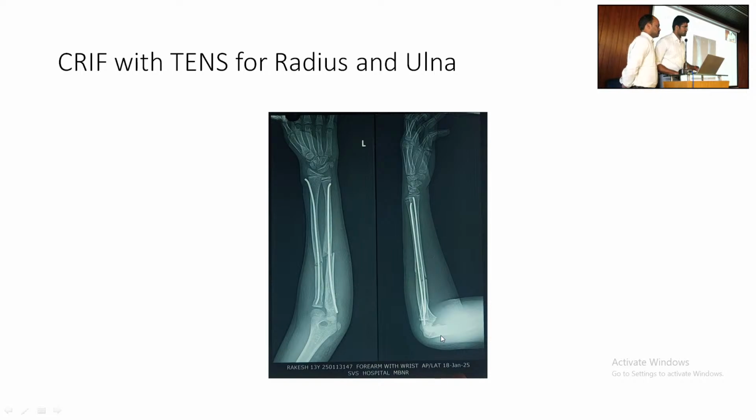Did you check on the C-arm whether the dislocation was unstable by trying to extend the elbow? Yes, sir, checked, sir. It was stable, sir. Post-operative X-ray also was stable, and under C-arm we have seen, sir. Usually it gets re-dislocated when the elbow is extended, that usually happens. Yes, checked, sir. It didn't get dislocated. It doesn't.